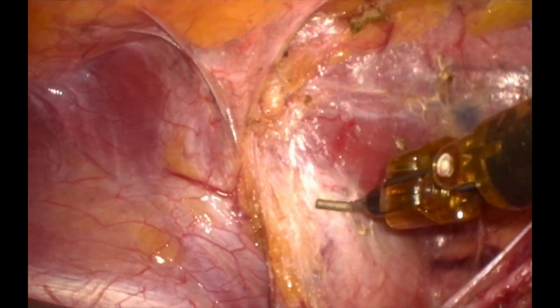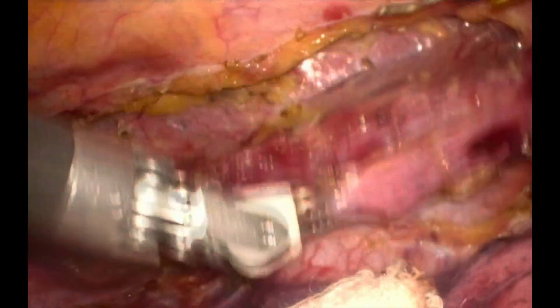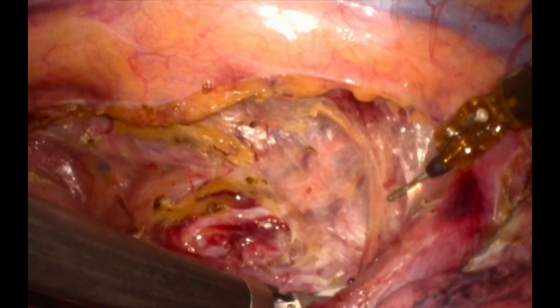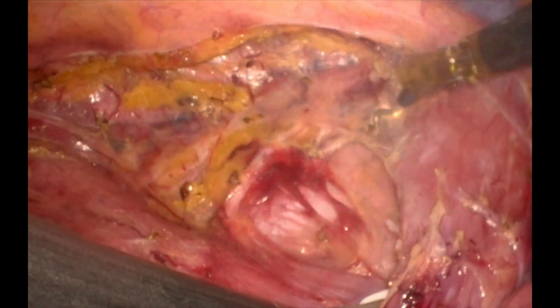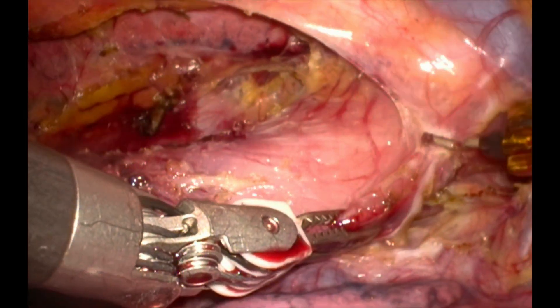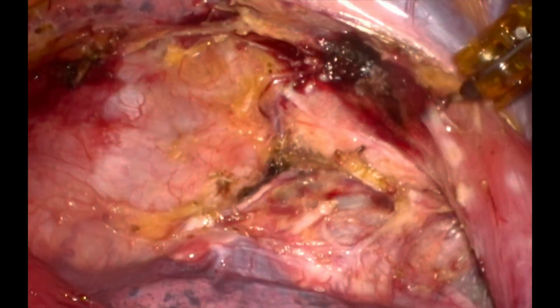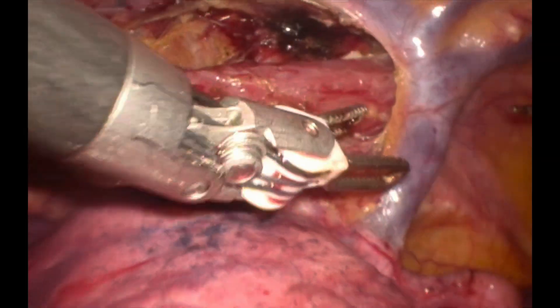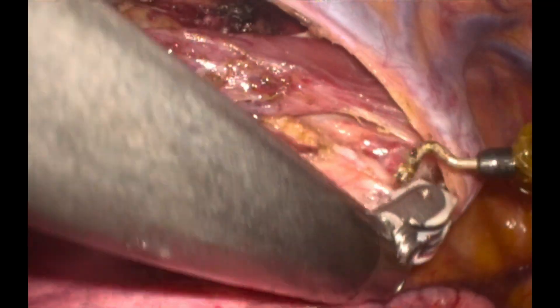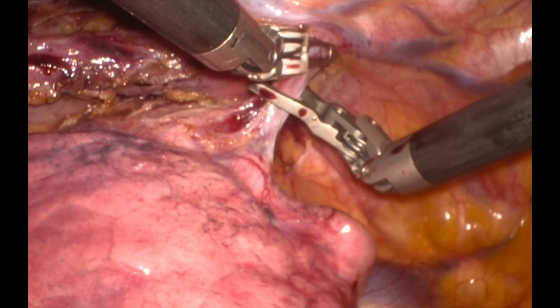The thoracic part of the phrenoesophageal membrane is divided and the esophagus at the gastroesophageal junction is separated from the diaphragm. The opposite pleura is seen and the dissection is continued carefully avoiding all vital structures, and the esophagus is mobilized all around. Once the esophagus is mobilized up to the azygos vein, we divide the pleura above the azygos vein, create a plane all around it, mobilize the esophagus around the azygos vein, then clip and divide it.